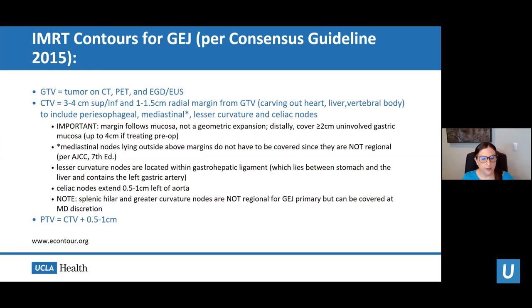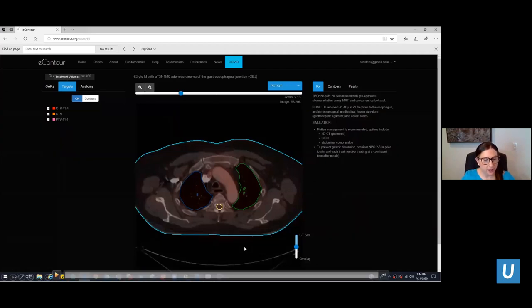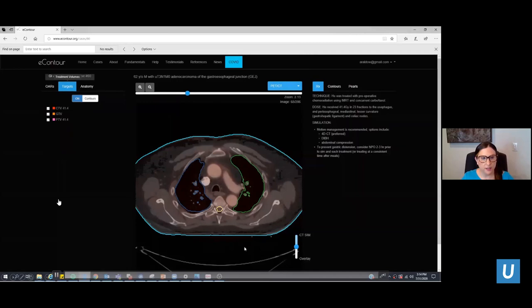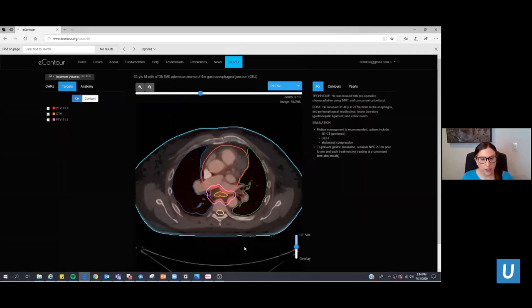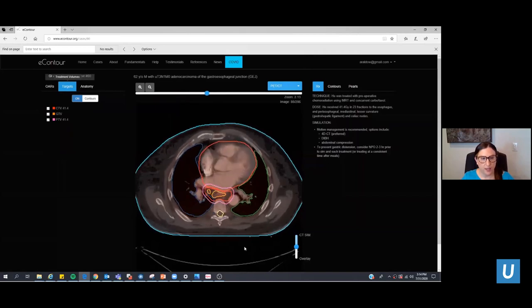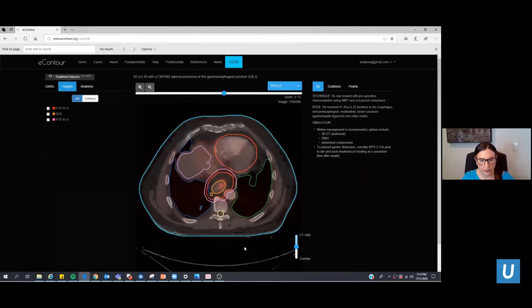The planning target volume, or PTV, depends on available image guidance. In our department we do daily image guidance, so we use a PTV expansion of 0.5 centimeters on those volumes. This video shows what the radiation treatment volumes look like: orange is the gross tumor volume, red is the clinical target volume, and pink is the planning target volume, fused with the patient's diagnostic PET-CT.